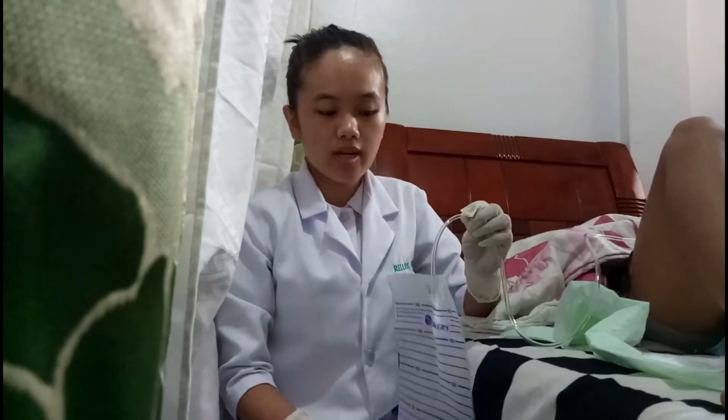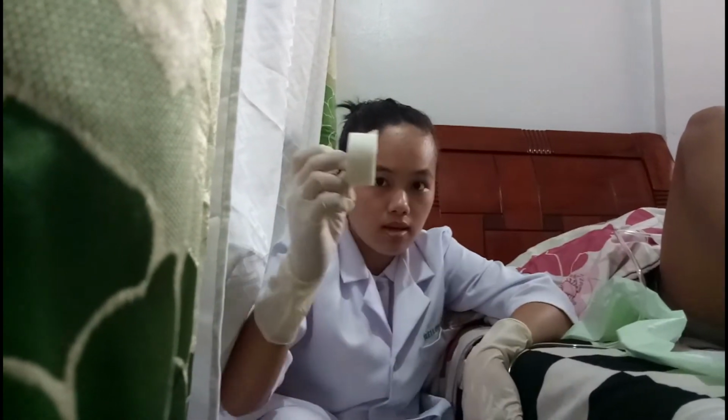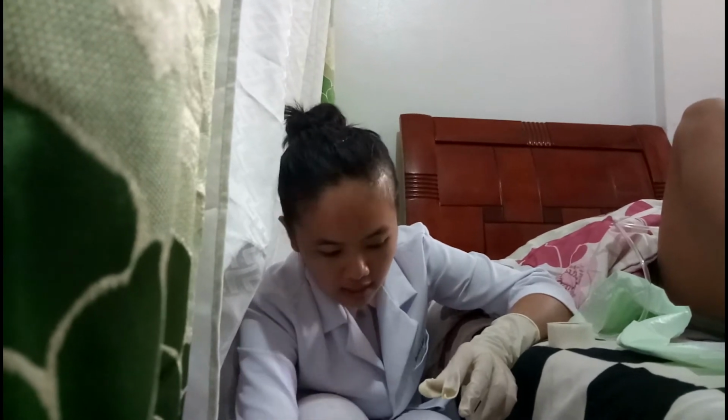So now, I'm going to attach the urinary bag to the bed, but I must make sure to attach it to the bed frame, not to a movable part of the bed, like the rail in the hospital bed. But for now, there is no movable part on this bed, so I'm just going to paste it here using a plaster so it is safer and the patient is comfortable. It should also not be far from the patient.